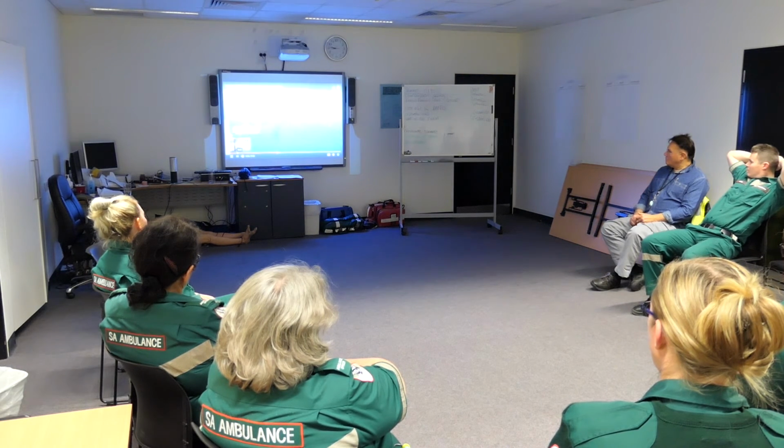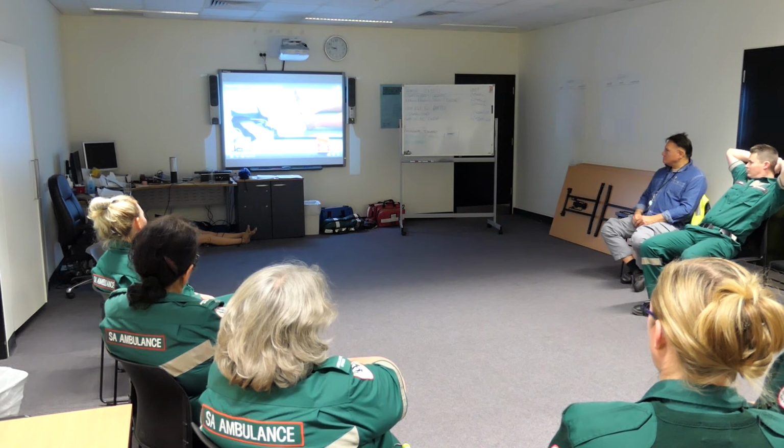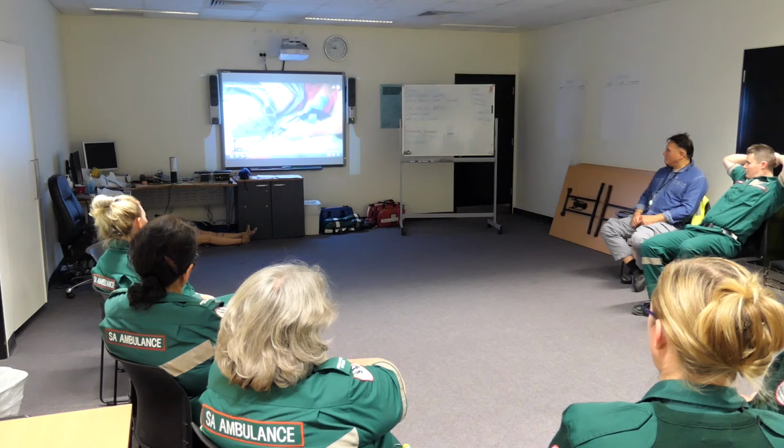Step 4. Sizing. To gauge the correct length, place the unit alongside the uninjured leg. Now the ischial cap should align with the top of the patient's pelvic crest, with the ankle hitch end approximately 15 centimetres beyond the bottom of the patient's foot. Step 5. Adjust length. If the splint appears to be too short or too long, tube sections should be added or removed as necessary for correct sizing. Now here, the correct size is accomplished by removing the ischial cap and one piece of tubing folded back. Now secure any disconnected sections with the ischial cap.